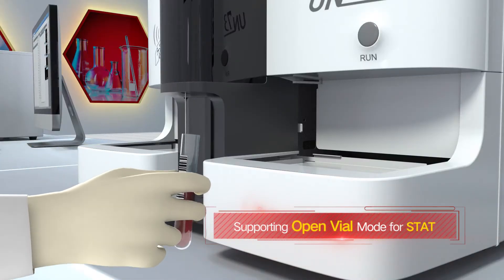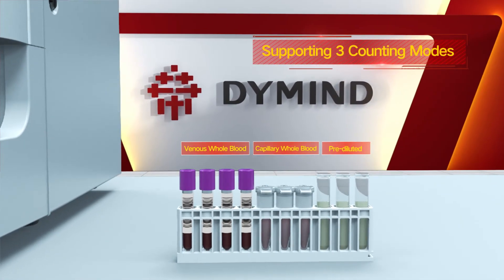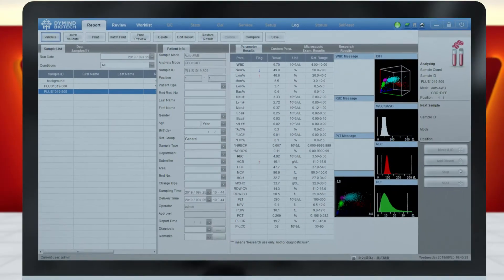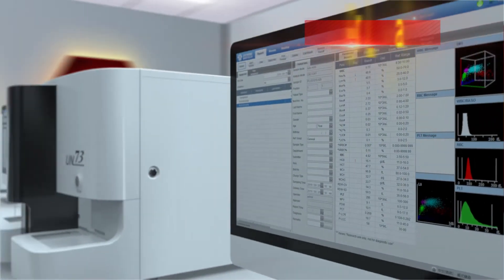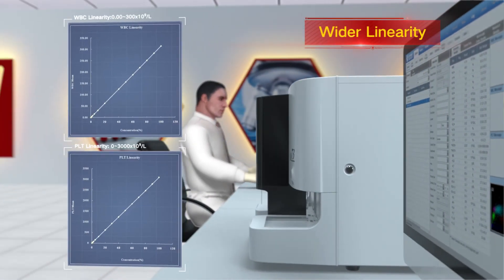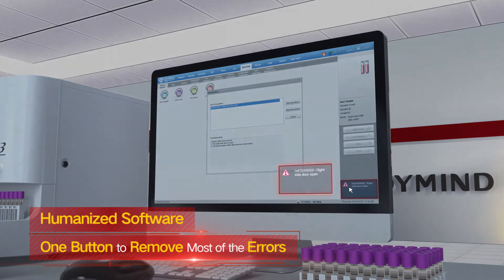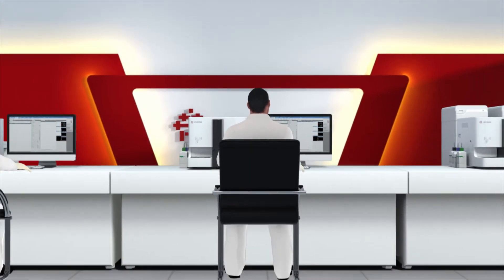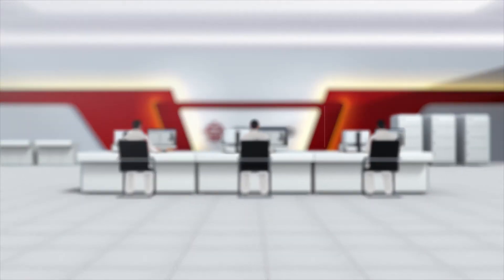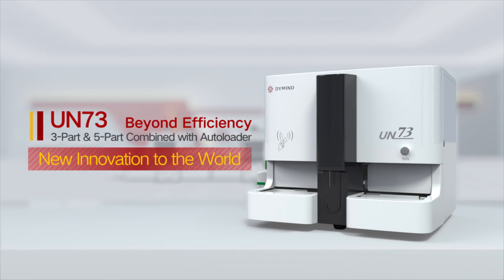The UN73 supports open vial mode for emergency samples and offers three counting modes. Wider linearity is more suitable for high-value samples, reducing the rate of reruns. One button can remove most errors in software, making the system more user-friendly. The UN73 — a new innovation to the world, beyond efficiency for you.